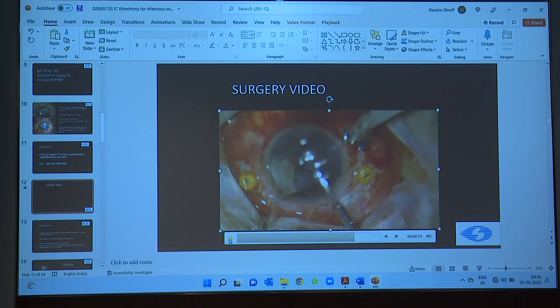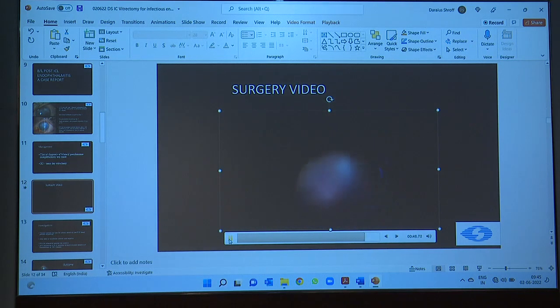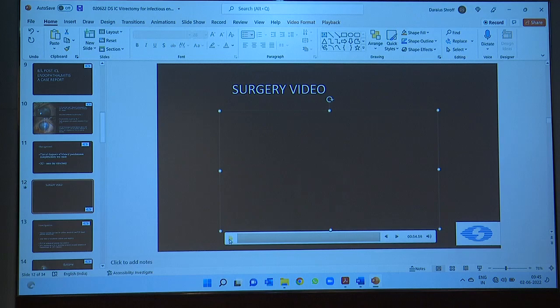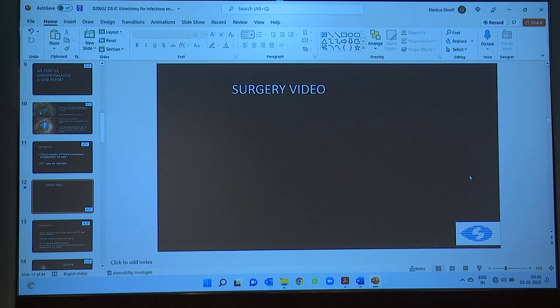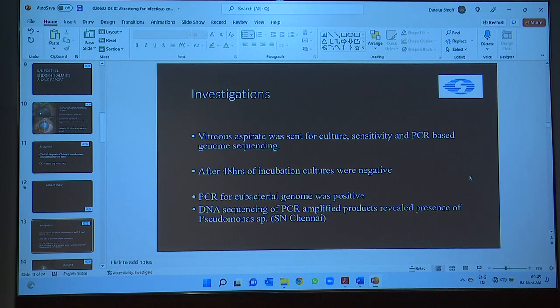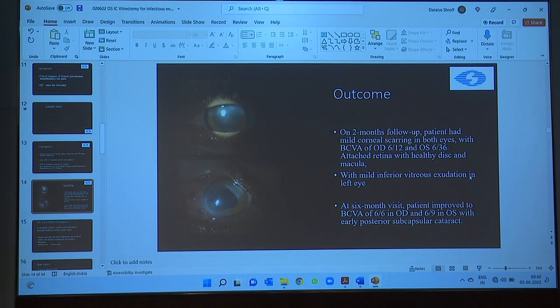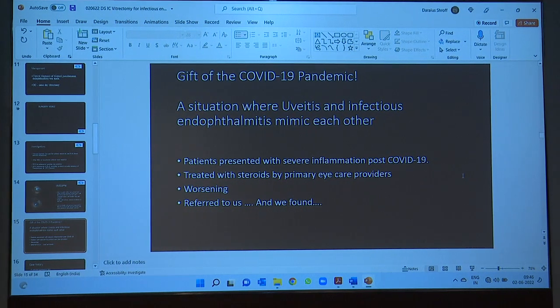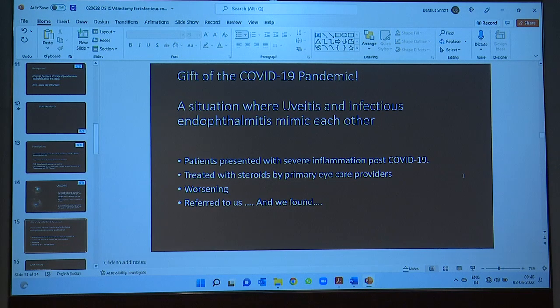After removing the ICL, the view became much better and we could see the optic disc. We sent a sample to the lab. Because the patient had already received intravitreal antibiotics, culture was negative, but PCR for ubiquitous bacteria was positive, and DNA sequencing revealed Pseudomonas species. Fortunately he had a relatively happy outcome — the infection cleared and at six months his vision was 6/6 in the right eye and 6/9 in the left eye, with early cataract in the eye where we did not perform lensectomy.